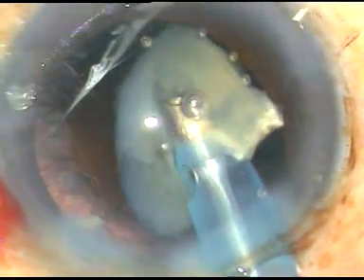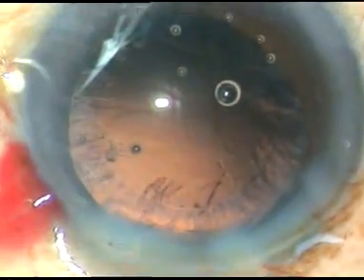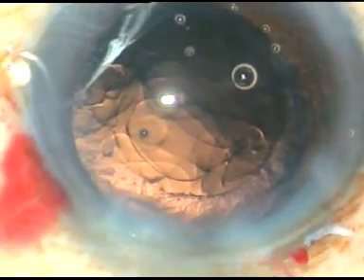This is the Oertly Catarix III phaco machine from Switzerland — a sweet, cute, very small and sturdy machine. No financial interest, but I am very happy to use this machine.